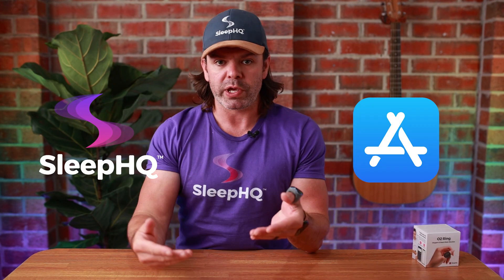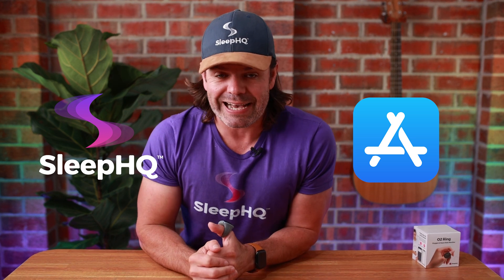Apple users — you can download our Sleep O2 app directly from the App Store and connect it to your Sleep HQ account for full wireless sync. What does that mean? You just wear your O2 ring, take it off, and all that information will transfer from the app directly to your Sleep HQ account for viewing alongside your CPAP therapy data.